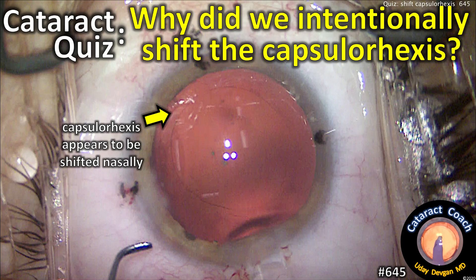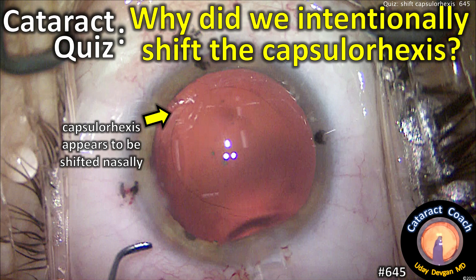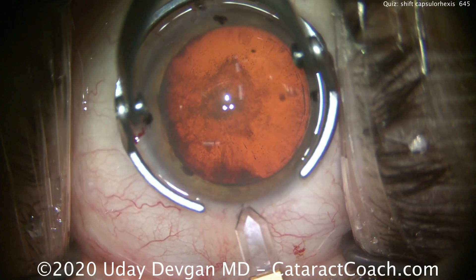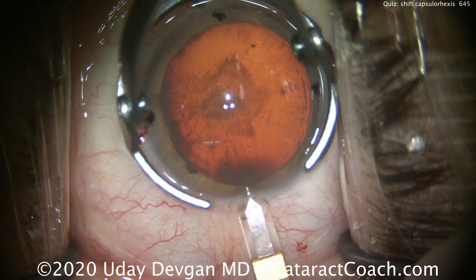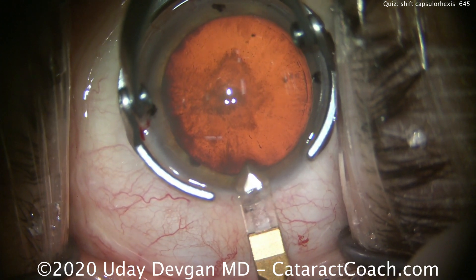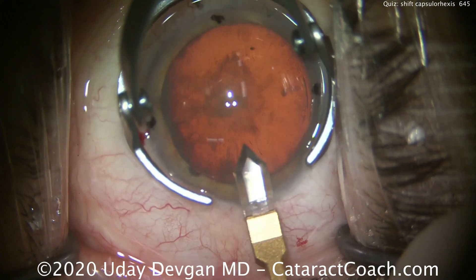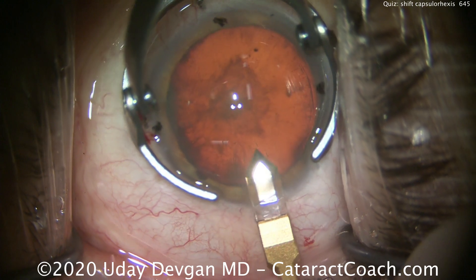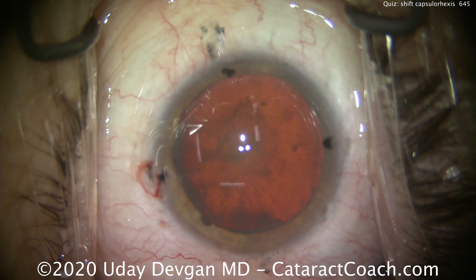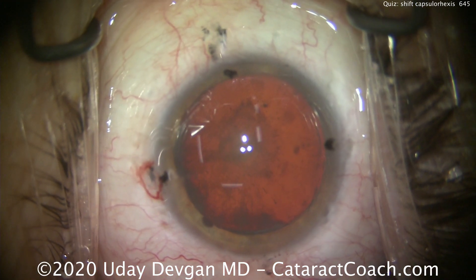CataractCoach.com. Cataract quiz: why did we intentionally shift the capsular axis? It looks like it's shifted nasally. Here's the case — you can see it's a posterior subcapsular cataract with other features as well. Using a diamond keratome here to make a temporal phaco incision of about 2.4 millimeters wide.